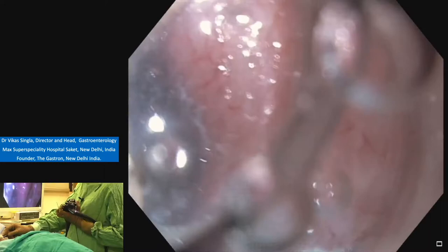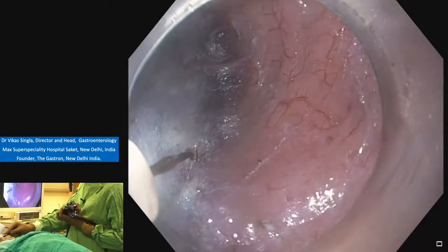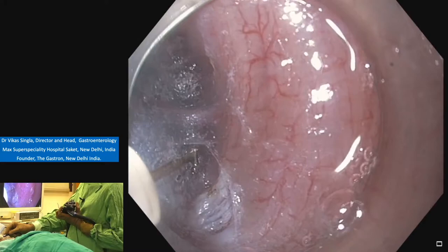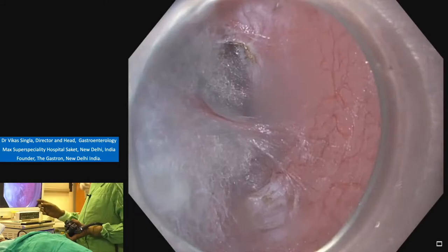You can see one more vessel there, out. So we have to separate fiber on the side of the vessel without traumatizing the vessel. Then again we have to use the coagulation. You can see that we have isolated the vessel from both sides.